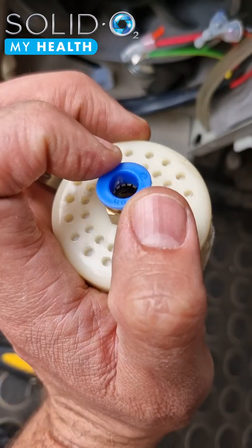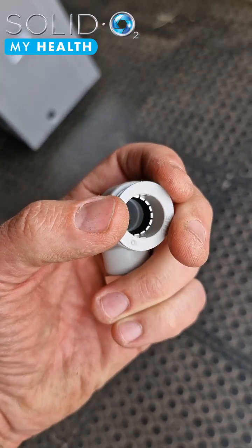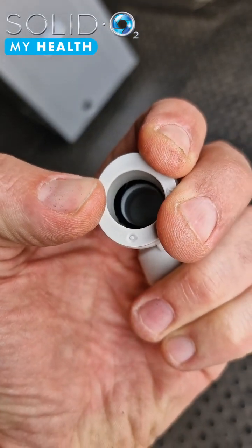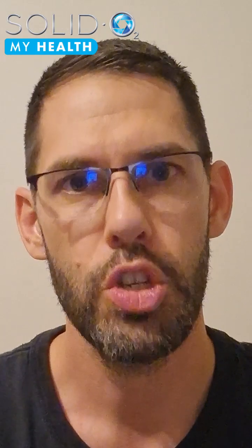If you find that you do have to disconnect a pipe, be careful. They're usually using a pneumatic connector. This means there's little teeth on the inside that grip onto the pipes. You should not force these pipes out. You have to pull the clip back to release the little teeth before pulling out. If you try to force the pipe out, you're going to damage your connector. Do not do this.